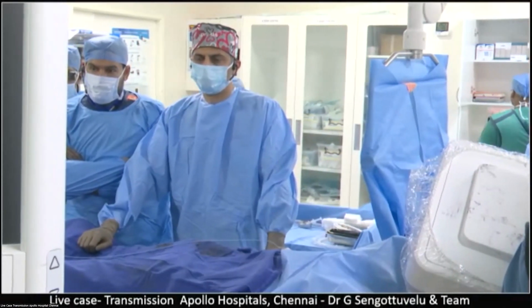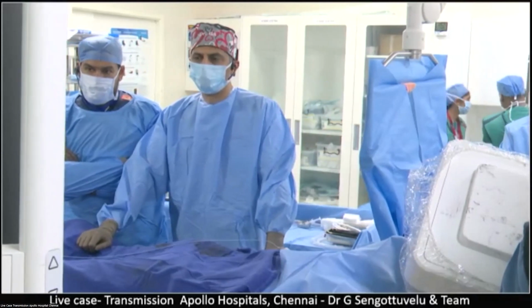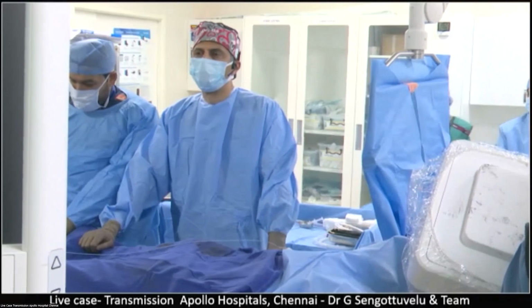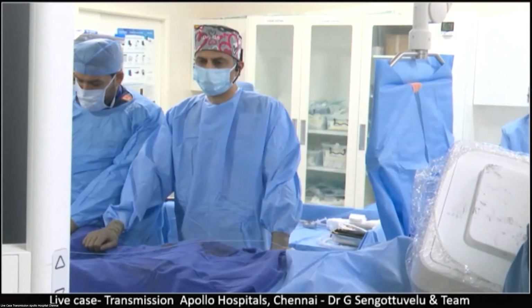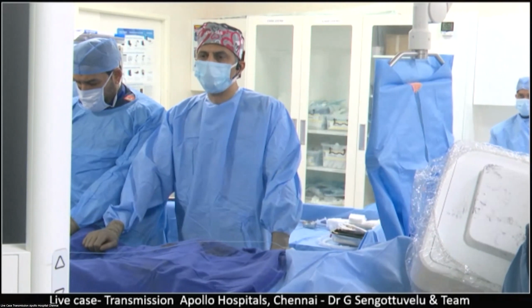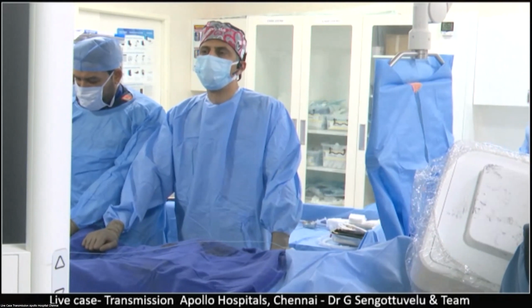So Evolut by perimeter would be a 29, but would people downsize to a 26? Yeah, I would possibly, because the aorta is a bit narrow. Maybe you downsize it to 26.